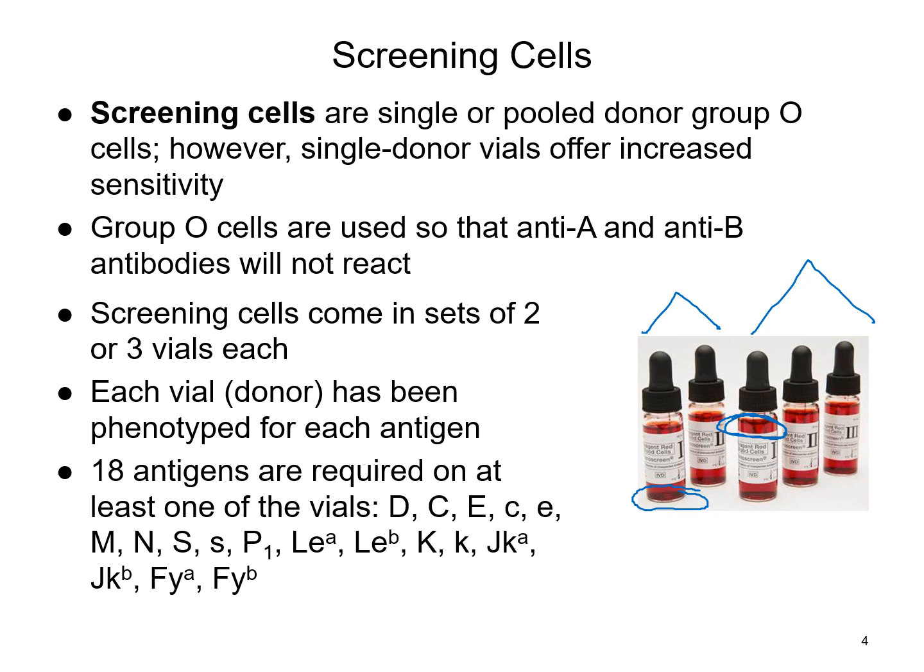So if you were testing a patient and you used these cells, when you spin it down, obviously that supernate is going to look hemolyzed, which means that could be a false positive reaction.